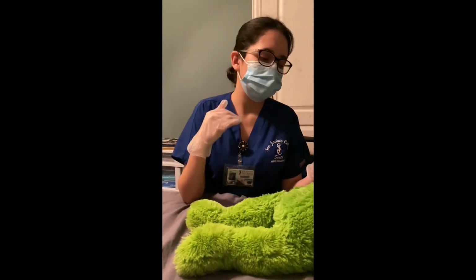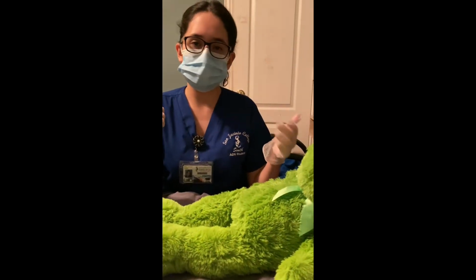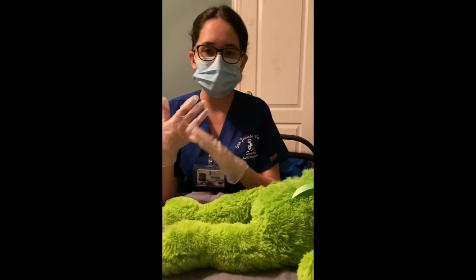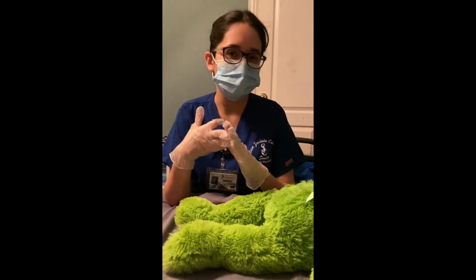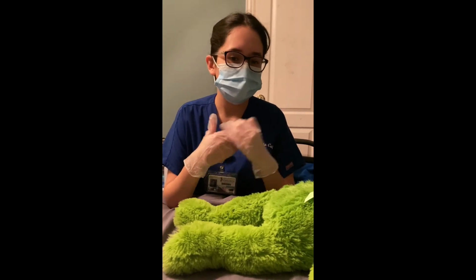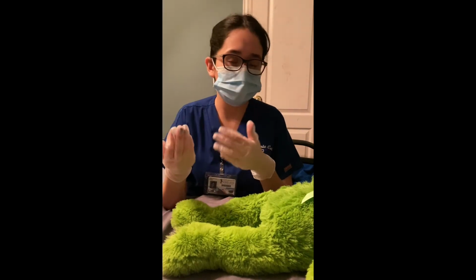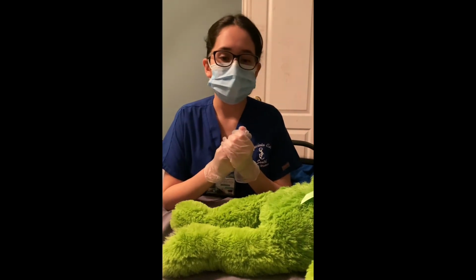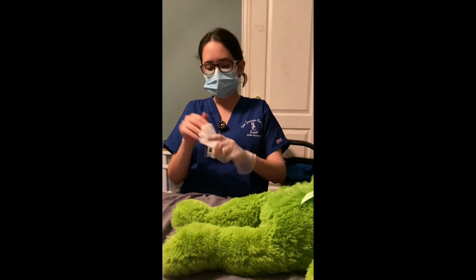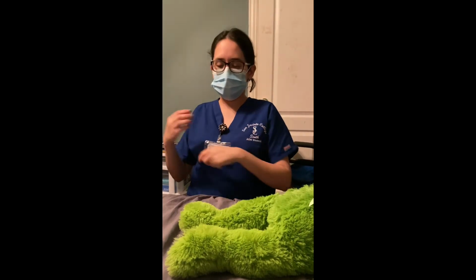And we're going to assess the patient's central venous line site for any signs and symptoms of infection like drainage, redness, warmth, or any other signs and symptoms that may be present. Since we've already assessed the insertion site and sutures, if there were any, we're going to remove our clean gloves, throw them away, and then perform some hand hygiene.